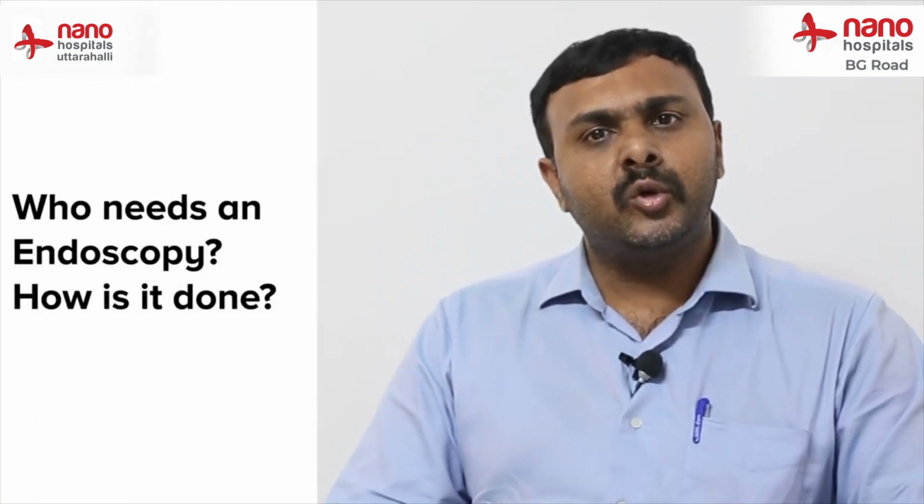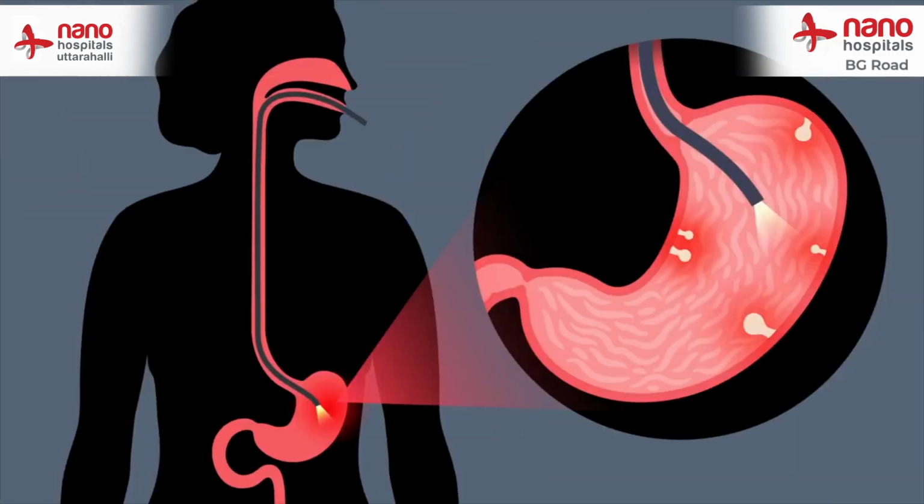So who needs an endoscopy? Whenever the surgeon or the physician feels that there could be some disease inside the GI tract which needs to be seen, then an endoscopy will be required to be done.